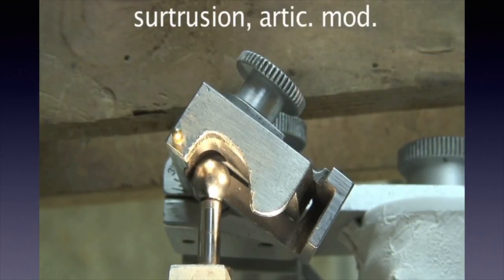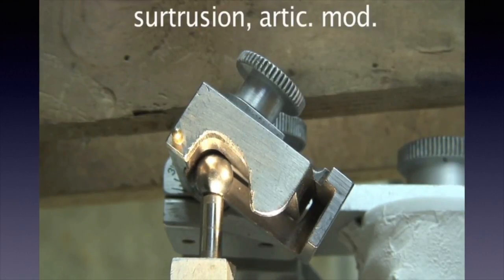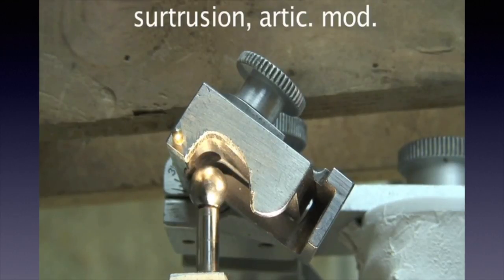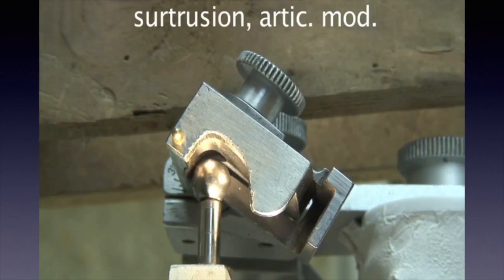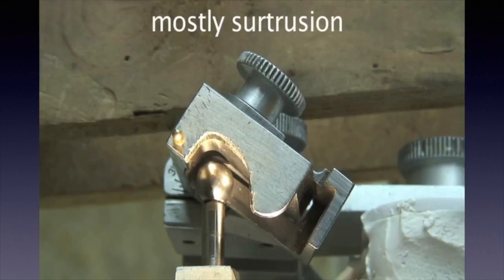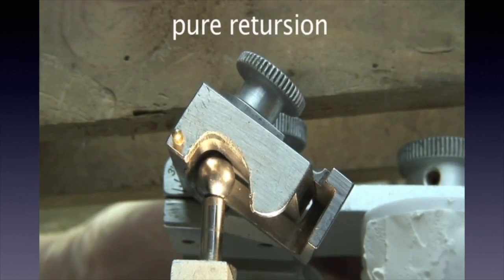This one is pure surtrusion and is the one that required that we cut the curved lip off the back of the articulator fossa so that the articulator could accept the MI posture. This one is some of each. This one was mostly surtrusion. And this one required retrusion only.